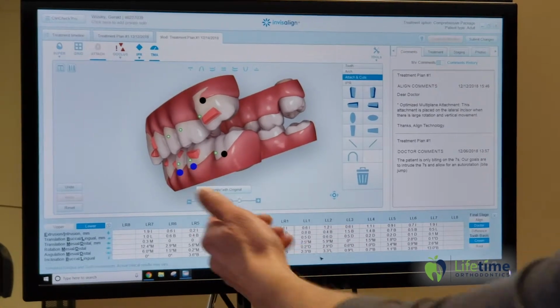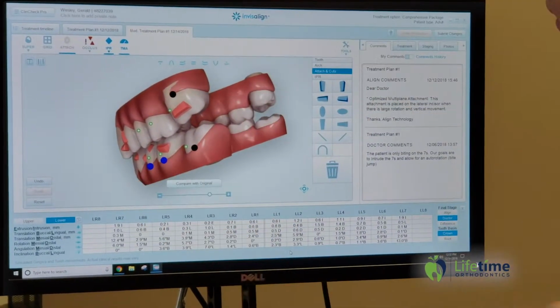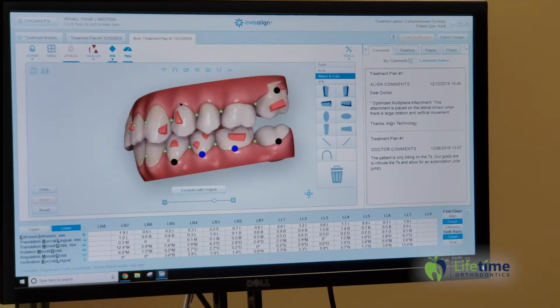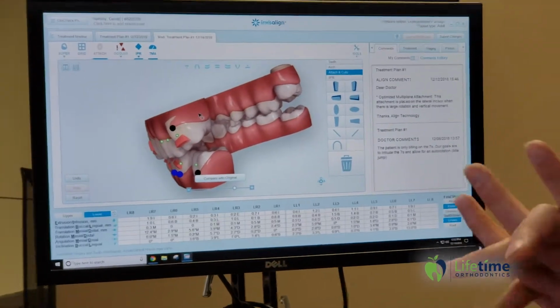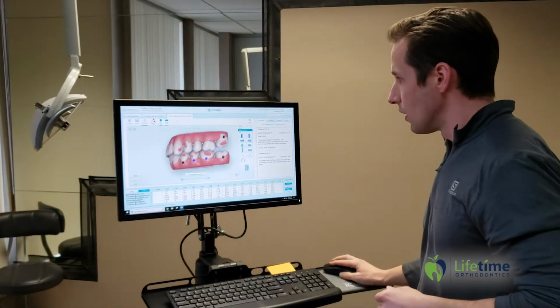So this is going to push, but what it's really going to do is hold this tooth in place as it pushes this tooth down, if you can understand that, okay? So my goal here in this first set of trays is just to get my posterior teeth out of contact and then reassess my bite and see how everything fits together, okay?